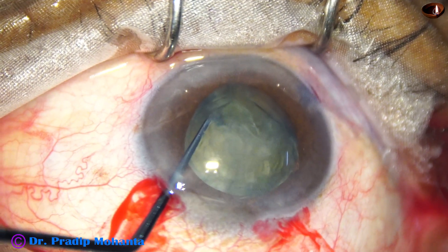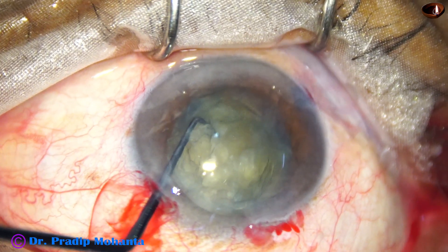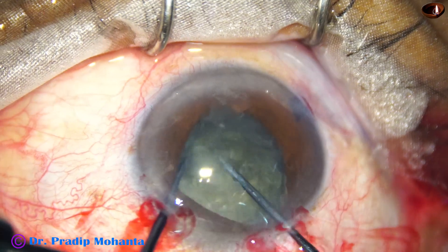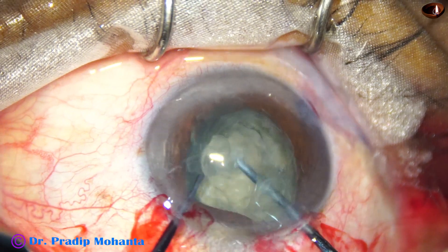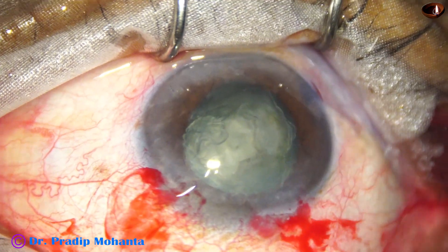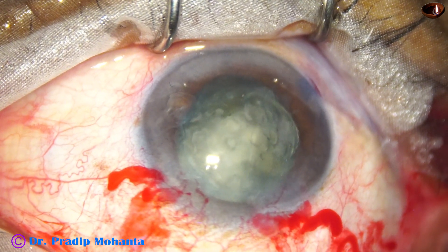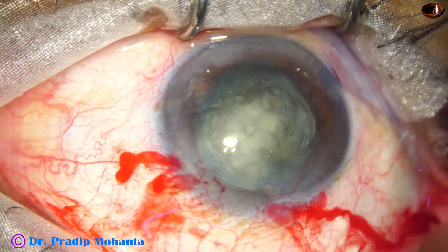I come out, inject viscoelastic — the sustainer remains inside — and use the pre-chopper again to make some smaller pieces. Yes, we have got some fragments. With viscoelastic in place, management of the nucleus will be easy because we are not going to struggle in having nuclear fragments — it is already done.